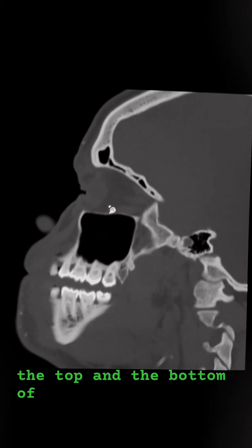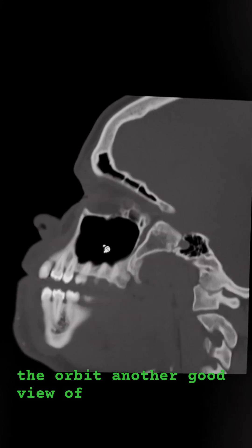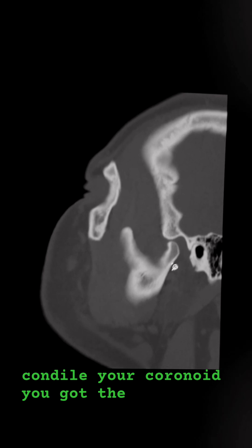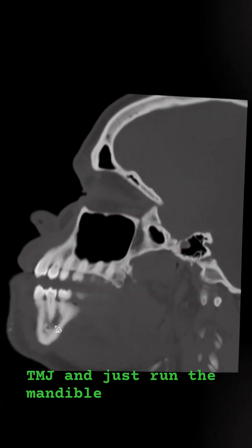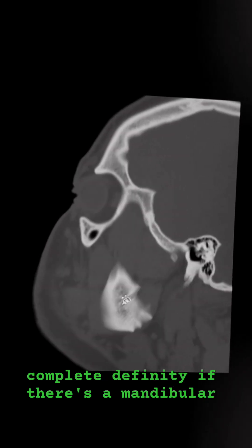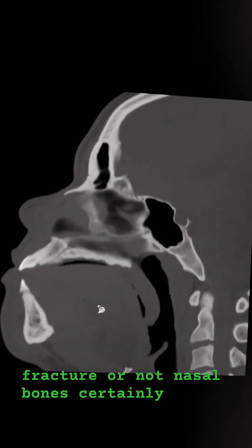If you want to look at the top and bottom of the orbit, there's another good view of it right there. You've got your condyle, your coronoid, and the TMJ. Just run the mandible right through — you see a hundred percent of the mandible. You can tell with complete certainty if there's a mandibular fracture or not.